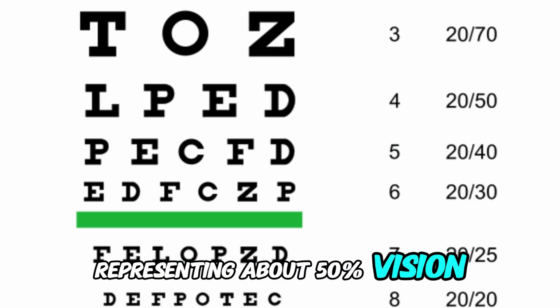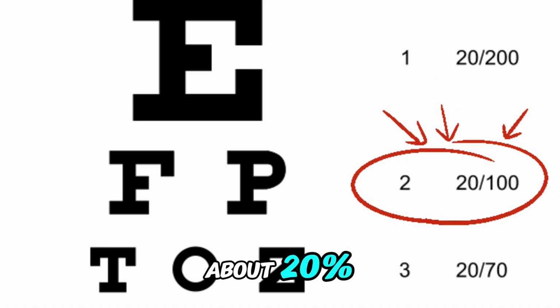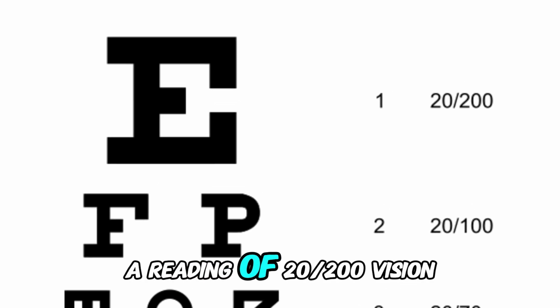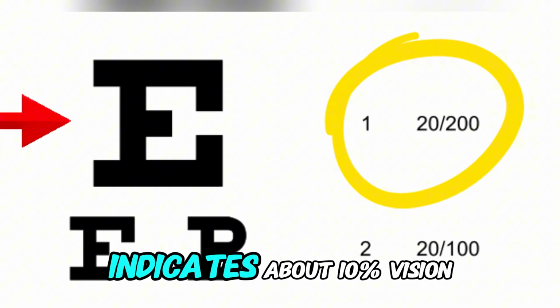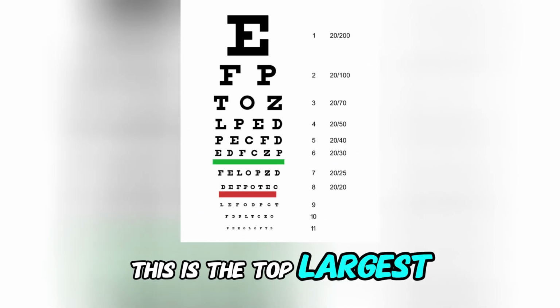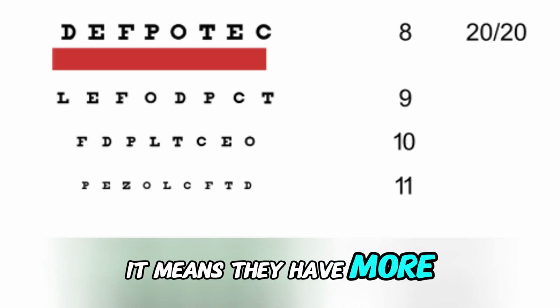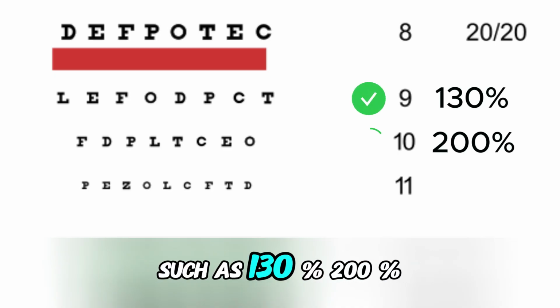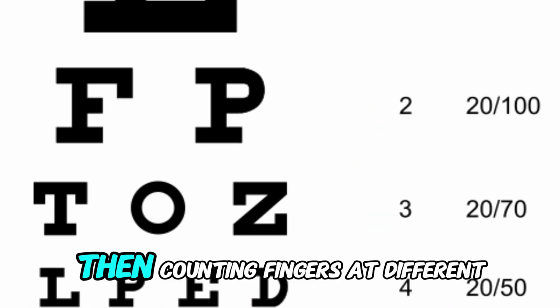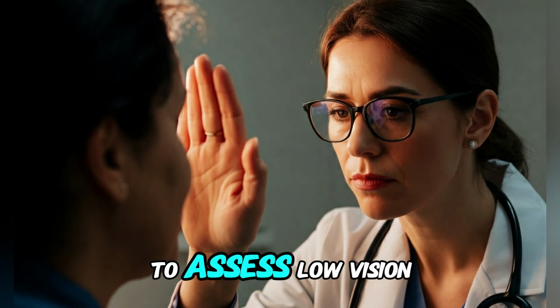about 50% vision. If the person reads at 20/100 vision, this means their vision is about 20%. This corresponds to the 2nd line from the top. A reading of 20/200 vision indicates about 10% vision and is considered legal blindness. This is the top largest line on the chart. If a person reads beyond the 8th line, it means they have more than 100% eyesight, such as 100, 200 or 250%. If a person cannot read the largest letter, then counting fingers at different distances, motion detection, and light perception are used to assess low vision.